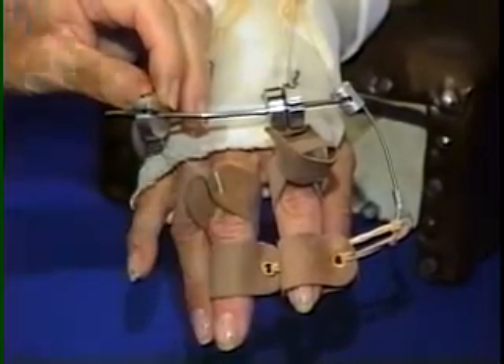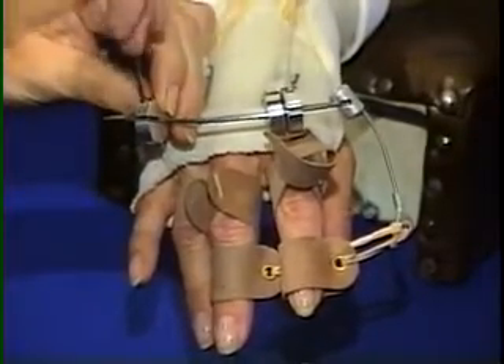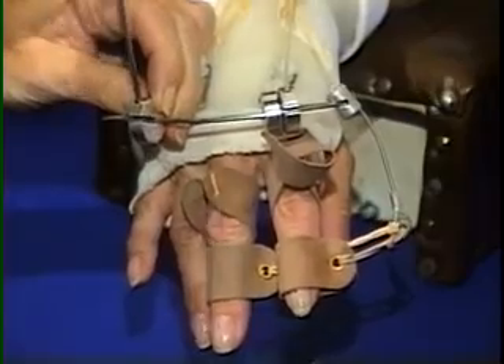Rotation for good pad to pad opposition to the thumb is particularly important in the middle and index fingers.